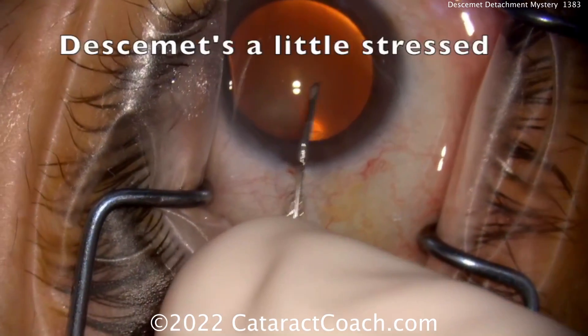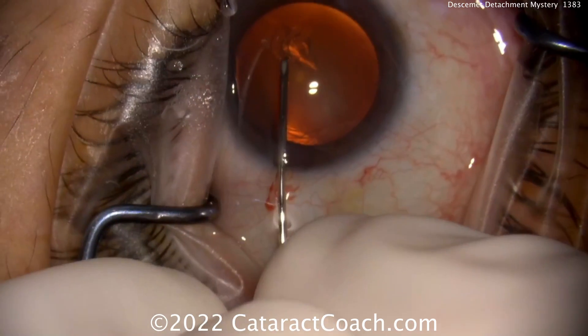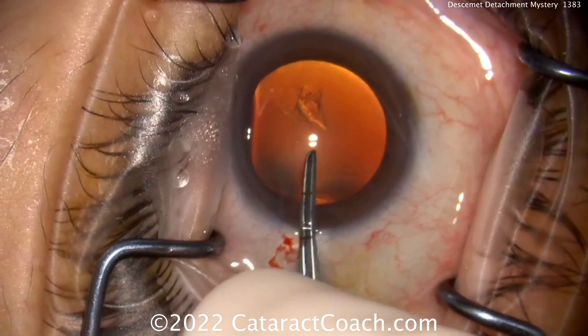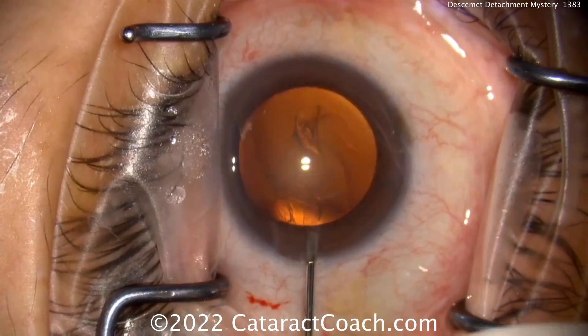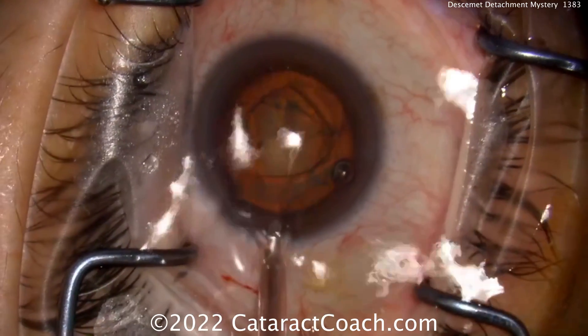During the rhexis you can already see there's a little stress on Descemet's. So while the rhexis is being done, there was a slight stress visible there. The good question is: when exactly is this issue occurring? I like your forceps there that are marked off, and now he'll complete the case.